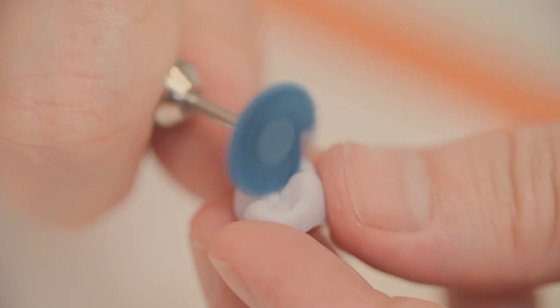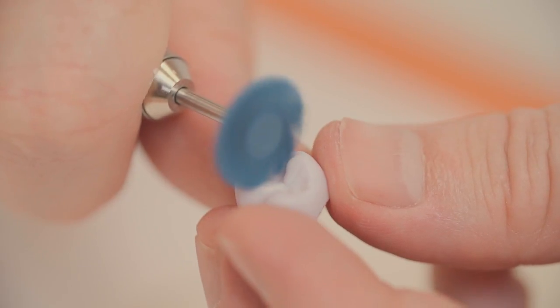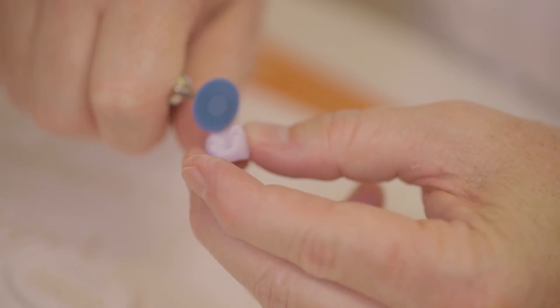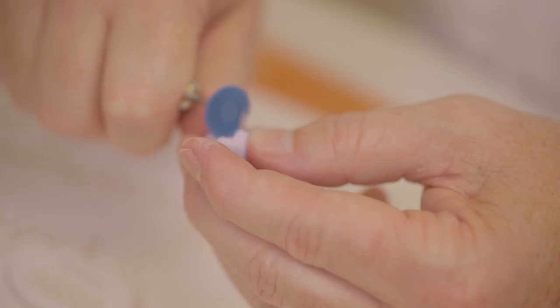Then we're going to go through our grooves just like with gold, but not with the heavy pressure. We're just going to walk it through and let it start to polish for us. I love how simple this kit is and how efficient it makes me and how repeatable and predictable this is.